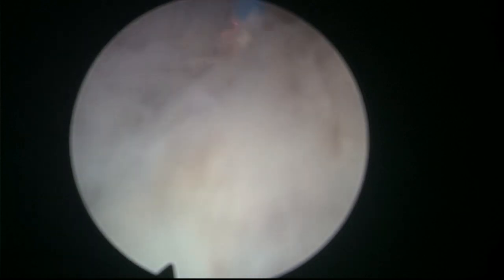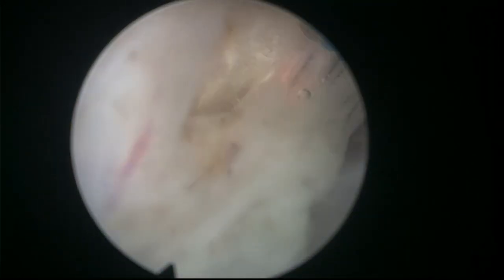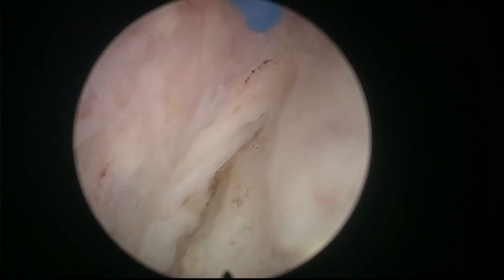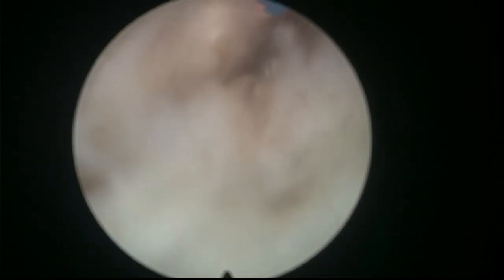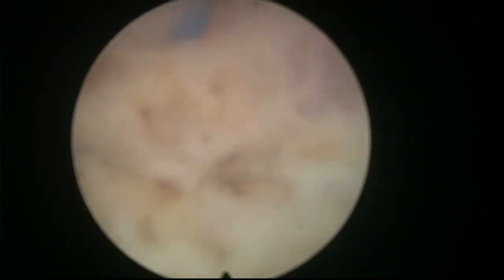So I'm not convinced that preserving the anterior tissue near the sphincter is the key. Some people who do the trilobar technique make an incision at 12 o'clock, but they start the incision 1 or 2 centimeters inside in order to preserve that tissue. I'm not convinced that that's the key to postoperative continence, immediate continence, and the rate of postoperative stress incontinence.